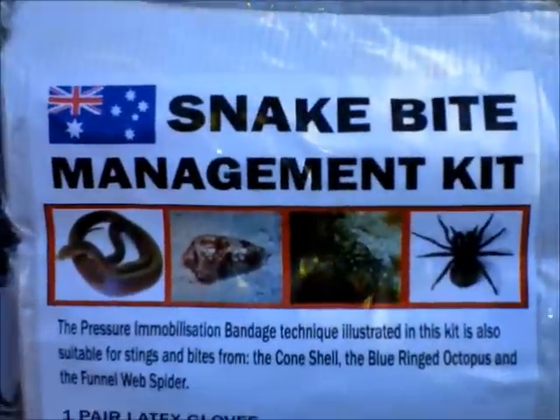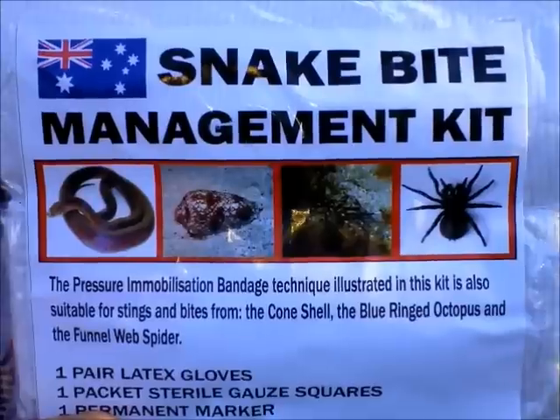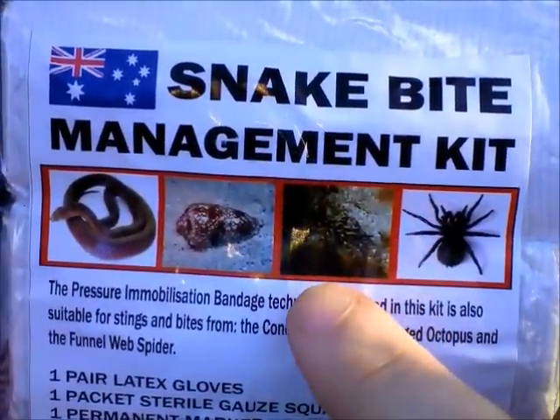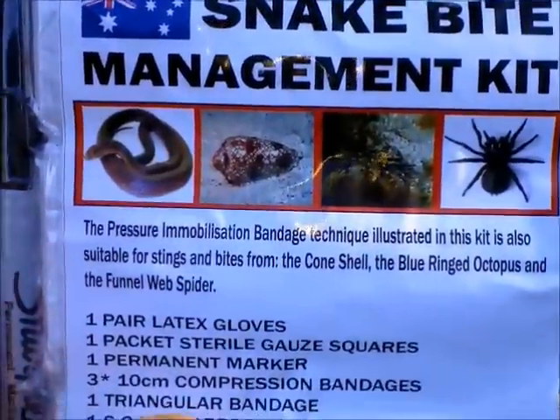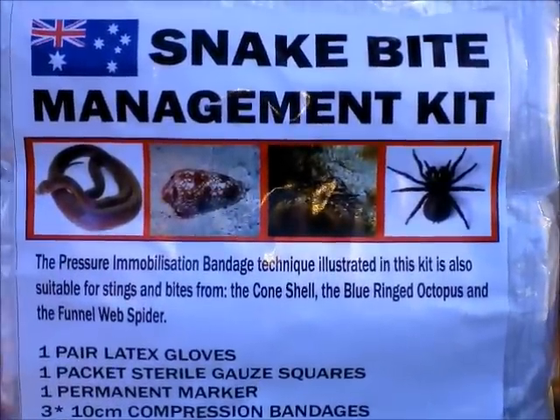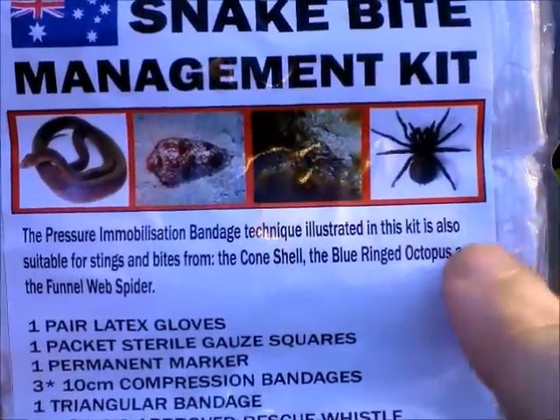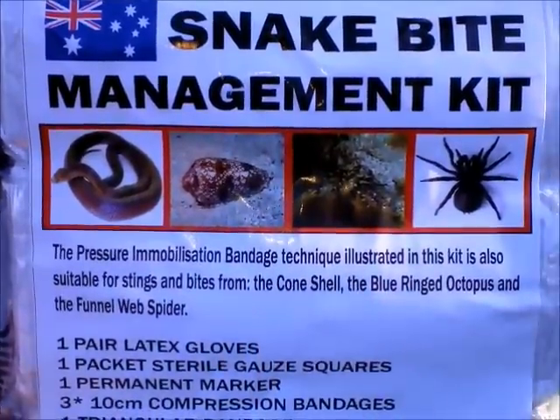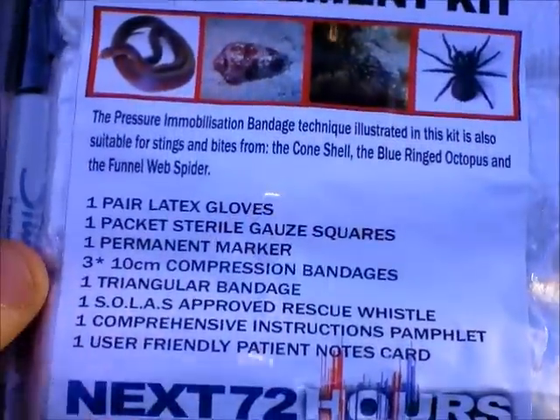Moving on, we'll have a look at this first diagram up the top. You'll see a number of different objects: on the right hand side we've got the funnel web spider, followed by the blue ringed octopus, the cone shell, and an Australian snake. This kit is actually designed to be used on all bites and stings from any of these creatures. The treatment for all of these is the same — that is, the pressure immobilization bandage technique — so it's really a very multi-functional kit.